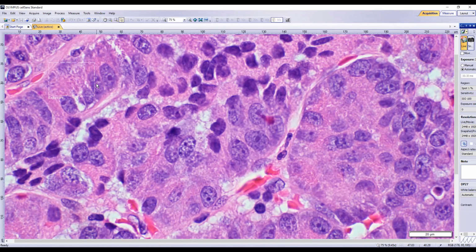Correct. So it has the morphology of a neuroendocrine tumor because of trabecular formation, but it has the cytology of acinar cell carcinoma because of prominent nucleoli. And then what's this? Is that those granules? Yeah, zymogen granules.